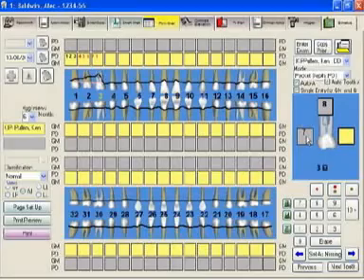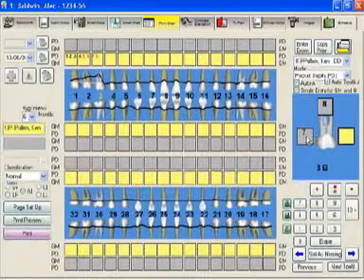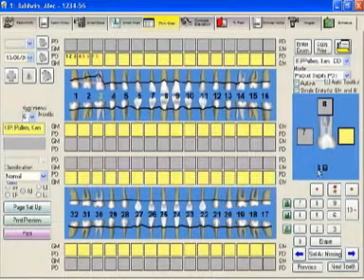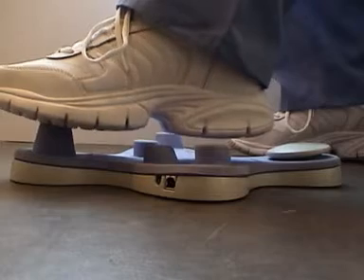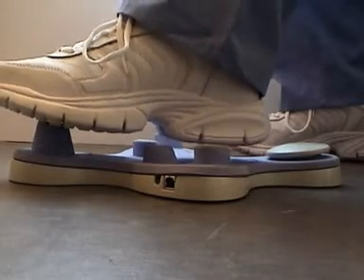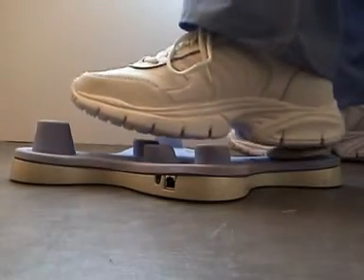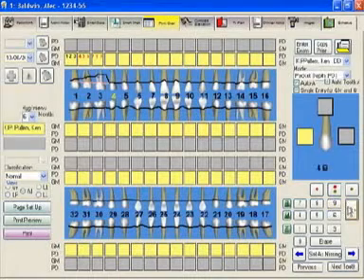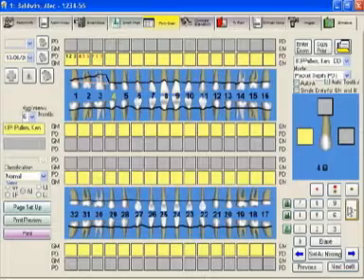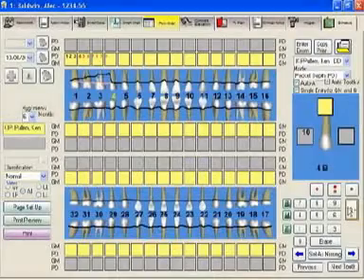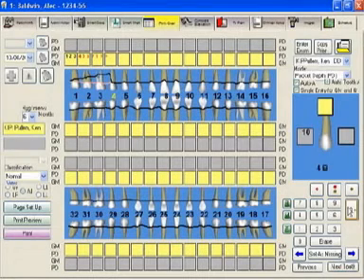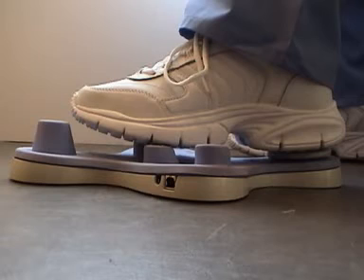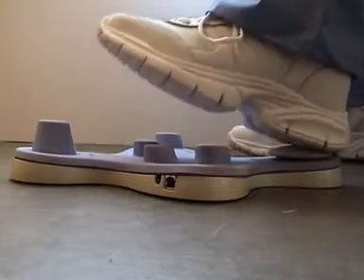If you have numbers higher than eight, you just simply mouse over with your toe to the number nine and you would heel click and it's going to enter the nine in. If you have a number ten and above, you mouse over with your toe to the ten plus and you heel click.